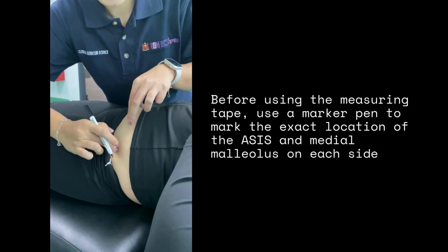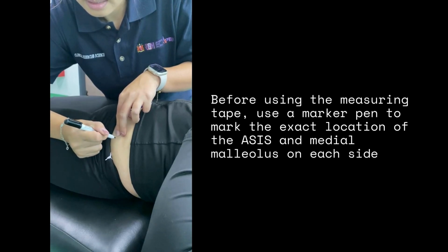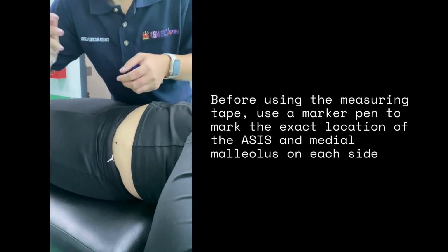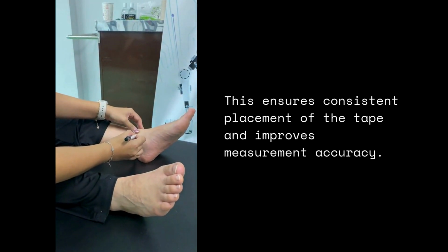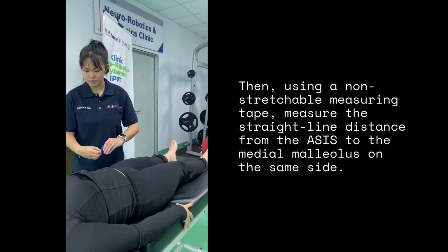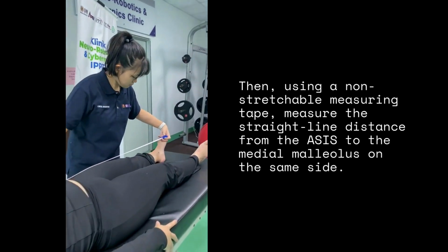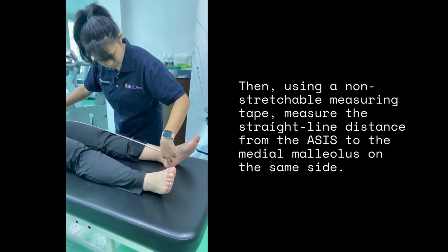Before using the measuring tape, use a marker pen to mark the exact location of the ASIS and the medial malleolus on each side. This ensures consistent placement of the tape and improves measurement accuracy. Then, use a non-stretchable measuring tape. Measure the straight line distance from the ASIS to the medial malleolus on the same side.